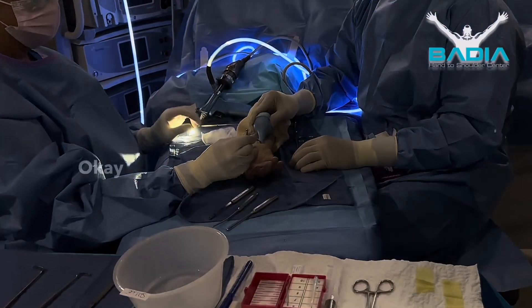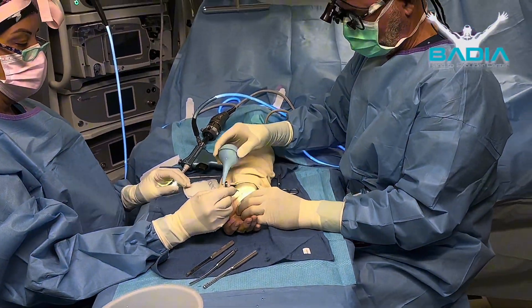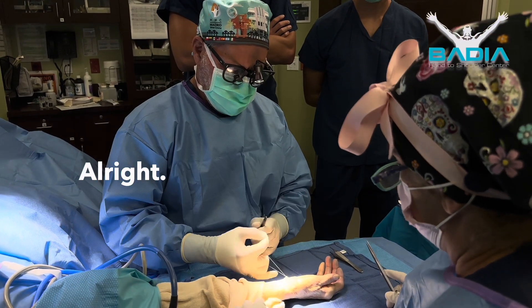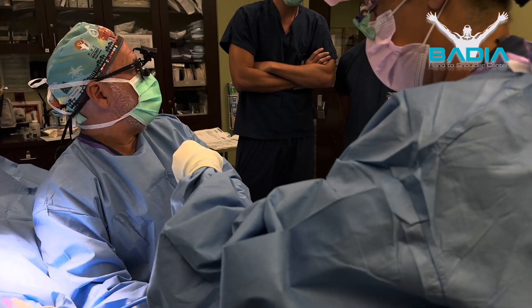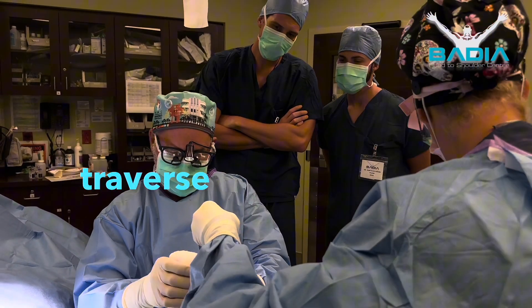So you'll see now when I do this, this will dilate. There you go. So there's several tests. How are we doing down there? Fine. So you saw — I released the anti-brachial fascia, I released the transverse carpal ligament.